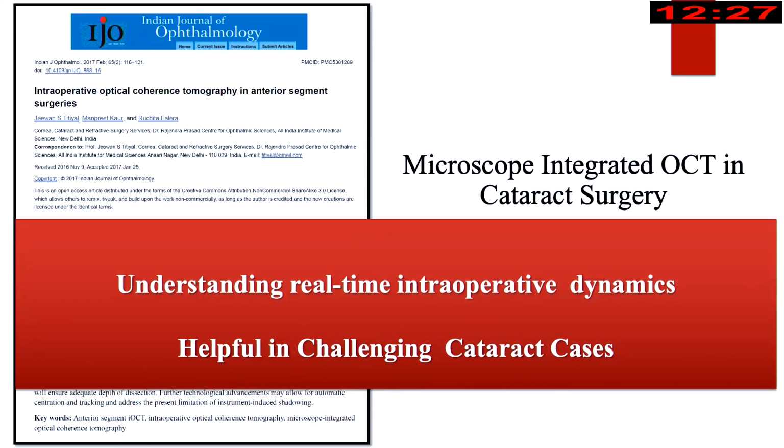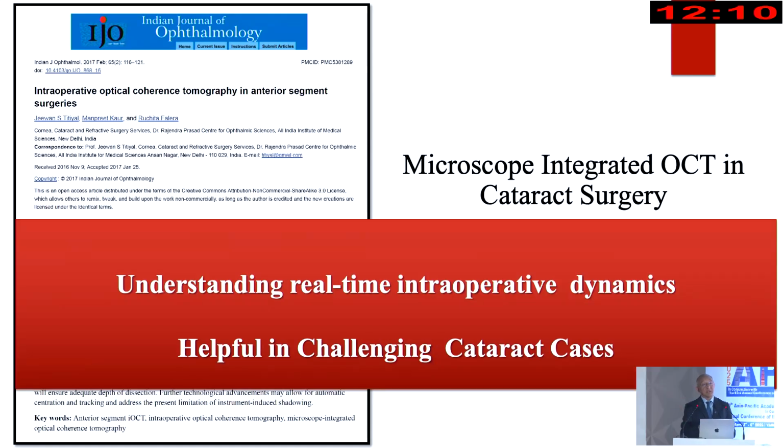The other important thing we realized while using the intraop microscope was it makes you understand the changes happening with each step of your surgery. Suppose I make an incision, I can see the incision right from the beginning to end, which was not possible earlier. You could see the incision only the next day when you do anterior segment OCT, that it is distorted, damaged, you have a Descemet's membrane detachment. That was only possible the next day if you take the patient to anterior segment OCT. This entire thing you can see now. Whether you have done a uniplanar, biplanar, or triplanar incision can be seen beautifully here.